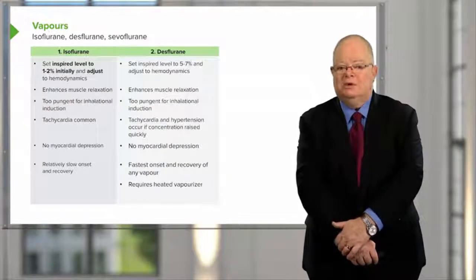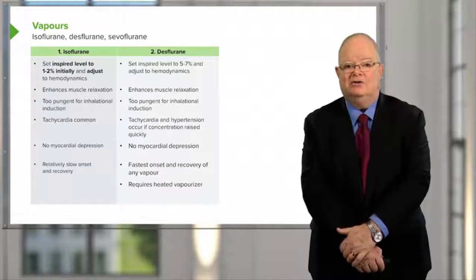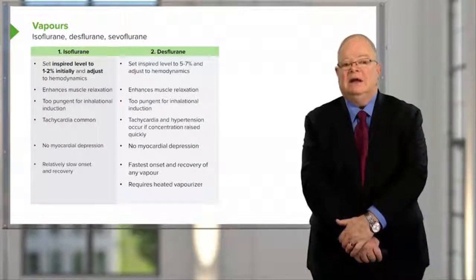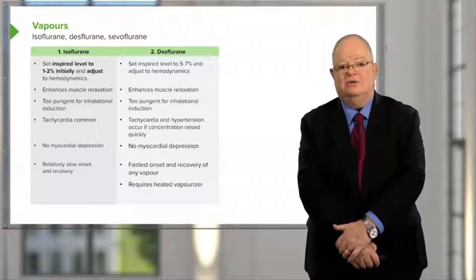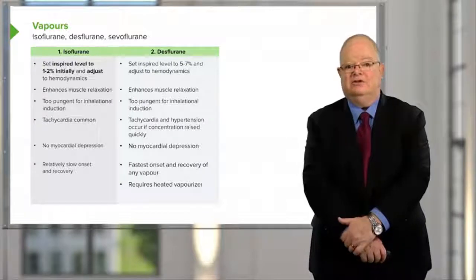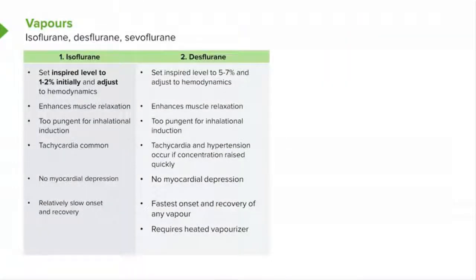Desflurane is not as potent as isoflurane, so you have to set it at a higher initial level, set it at 5 to 7%, and again, adjust to the patient's hemodynamics. It also enhances muscle relaxation, as all the vapors do. It also is too pungent for inhalation induction. Tachycardia and hypertension occur if concentration is raised quickly. If you only raise it a little bit at a time, you don't get tachycardia and hypertension. There's no myocardial depression. Again, it's the fastest onset and recovery of any of the vapors, but it requires a heated vaporizer, which is a more expensive device and requires more careful calibration.